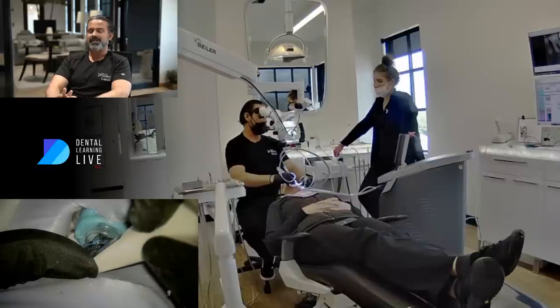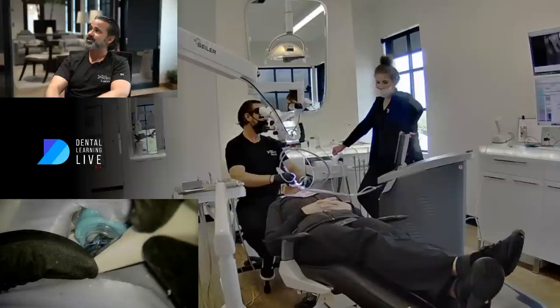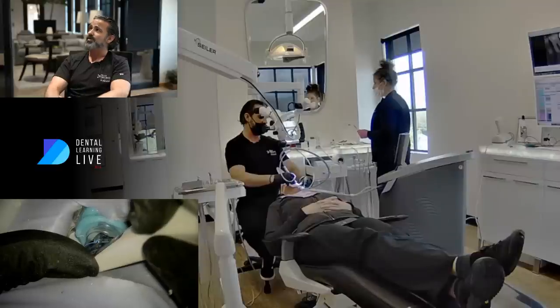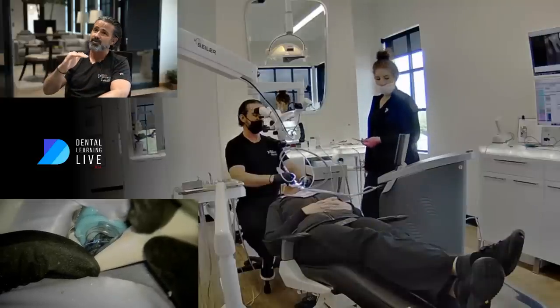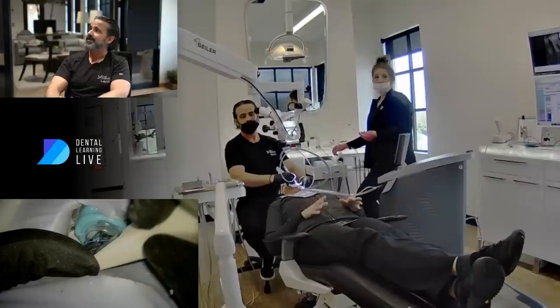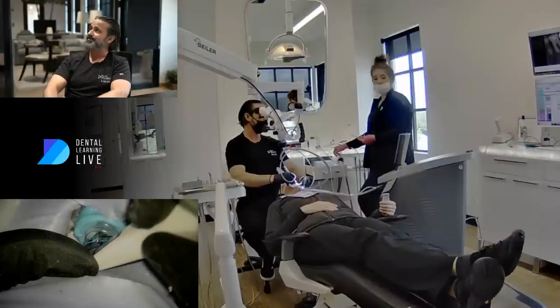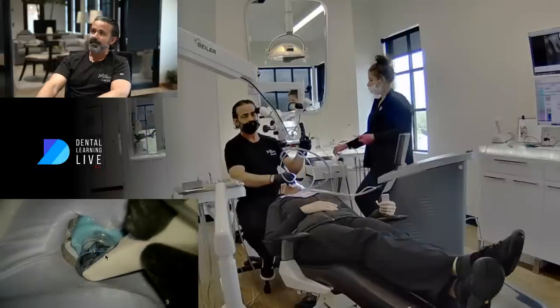The other thing I've noticed is my patients have been really happy with it — it's kind of a really gentle hum, described that way from the patient's perspective. I do really anesthetize them. I like an interosseous injection on lower molars, especially with pulpitis. My patients just kind of get used to the sound — there's a sound going on in their own head with this procedure. My patients have noise-cancelling headphones on and they're watching TV on the ceiling — Netflix. That's what the remote is in their hand; she's actually picking another episode. Non-eventful, which is good.